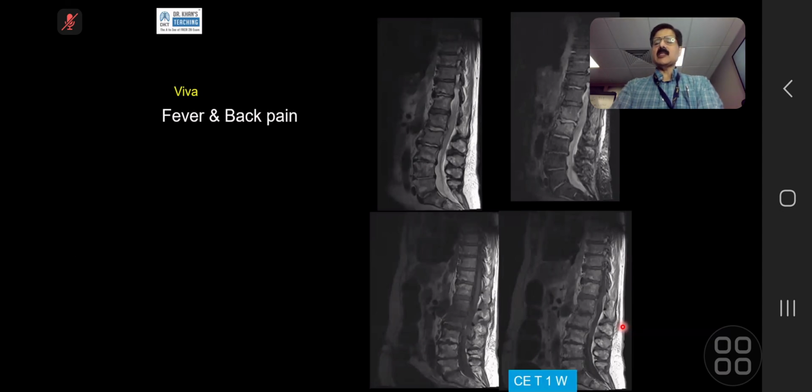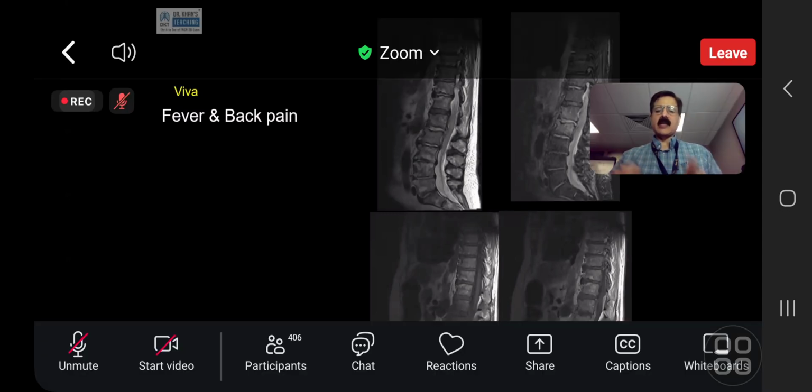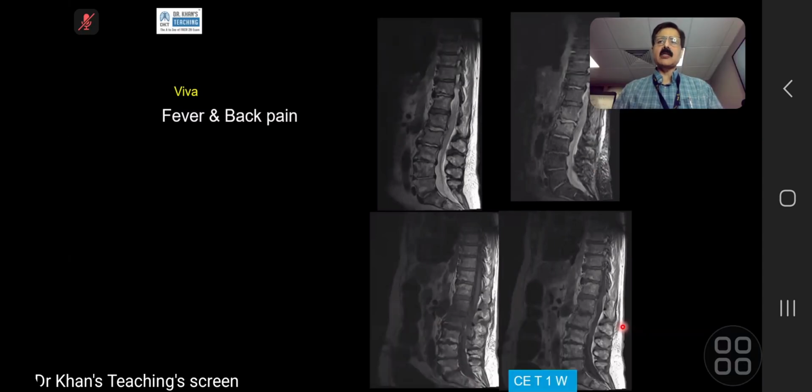And this is an extremely important finding. It is extremely important in head and neck also. By the way, it is extremely important in the liver also. But let me give you the context. When there is an infection, there is liquefaction. When liquefaction happens, then there will be a liquid component and the margin will enhance. That is drainable. Before that, it will not be liquid. So you put in a needle, there will be nothing to drain.